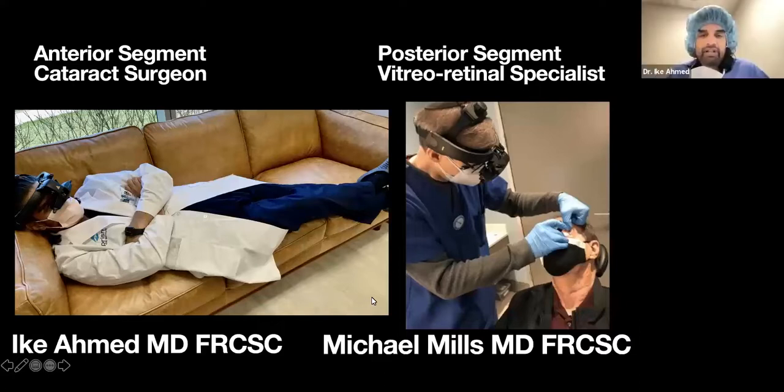Well, let's keep on pushing here. My next question is, as part of your pre-op evaluation prior to cataract or anterior segment surgery, do you routinely perform a dilated fundus exam to assess the posterior pole and peripheral retinal pathology? And here the answers are pretty straightforward. It's either no, it's yes, or it's referred to a retinal specialist. So I'll let people answer.